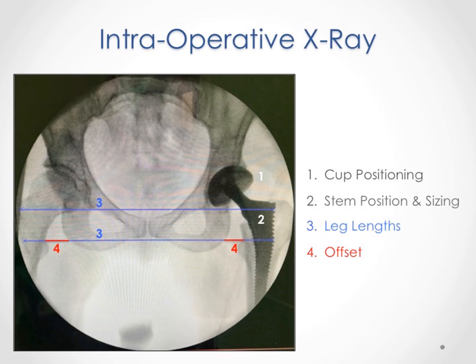Then the stem is checked to ensure proper sizing and alignment. The leg lengths are checked using the same method employed during the preoperative determination of leg lengths. However, this time we are looking and comparing two lines: the teardrop line and a line drawn across the lesser trochanters. In this radiograph, the teardrop line is the top blue line labeled 3, the lesser trochanter line is the bottom blue line labeled 3, and we can see they are perfectly parallel, indicating that we have corrected the initial 5mm discrepancy. The offset measured by the distance between the top of the lesser trochanter and the pelvis is then checked, and the goal is to have the same offset in both hips.